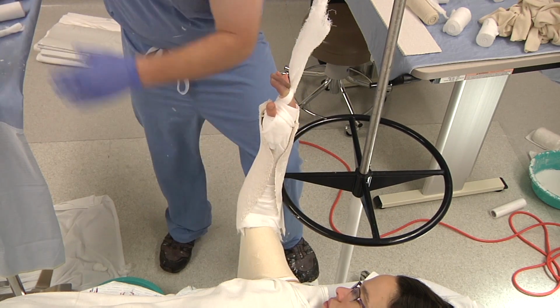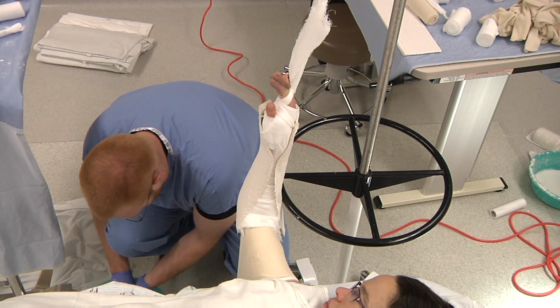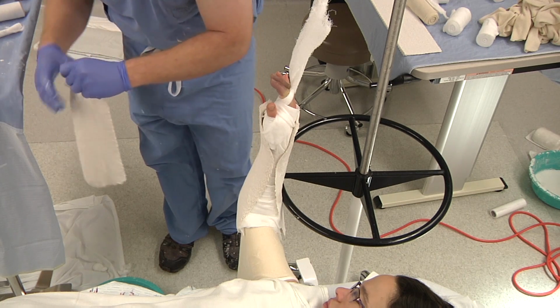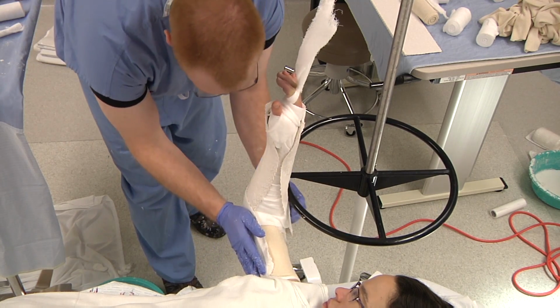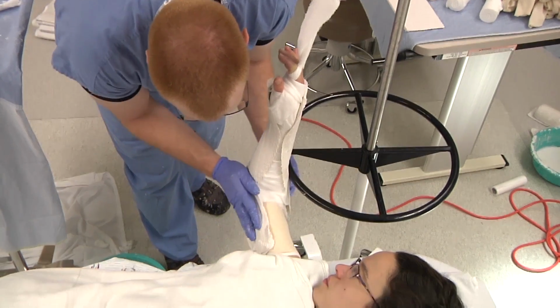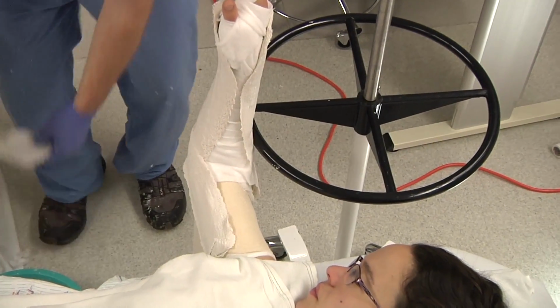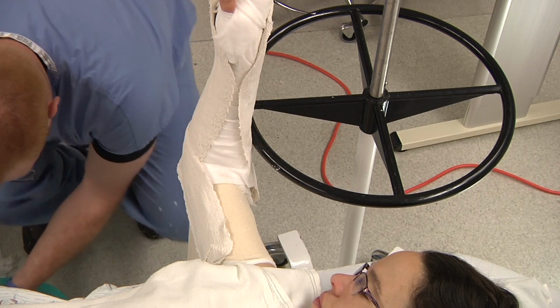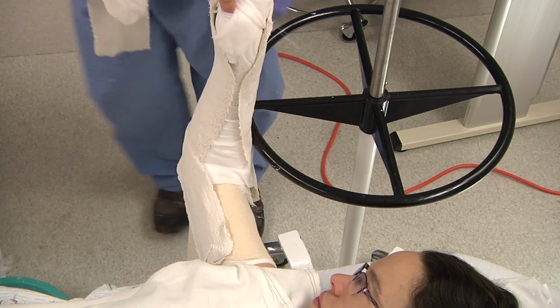And since we have already got our traction on there, which is aiding in our reduction and generally in distal radius fracture, getting our length that we desire, we actually keep our traction and padding on there, coming up high. Know where you're ending, and we can leave that underneath the splint. Because that's helping us. So we'll let it help us.